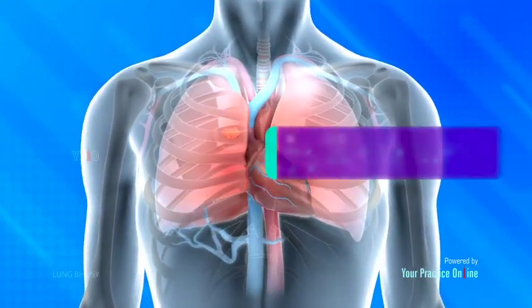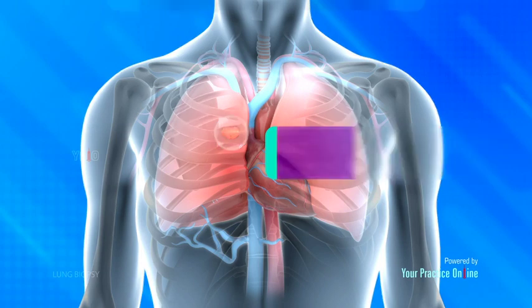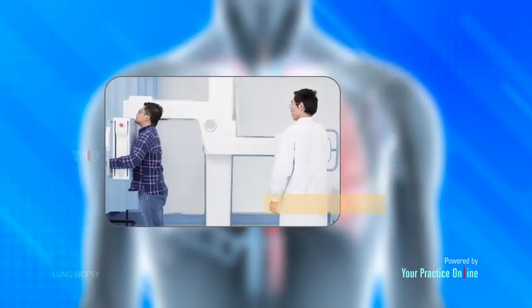A lung biopsy is a procedure performed to isolate a sample of lung tissue to examine under a microscope for the presence of cancerous cells, infections, and other lung conditions. The procedure is used as a diagnostic tool for the confirmation and staging of cancer and lung conditions such as pneumonia and pulmonary fibrosis, scarring of the lungs. A lung biopsy is typically recommended when your physician suspects something unusual on your chest X-ray or CT scan.